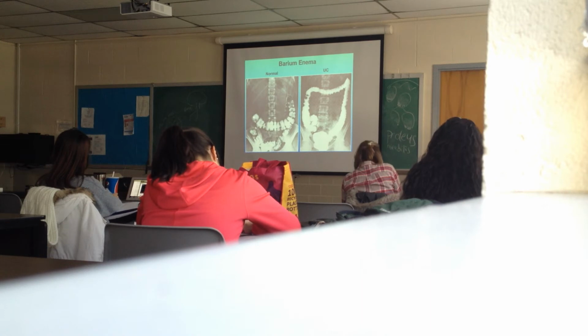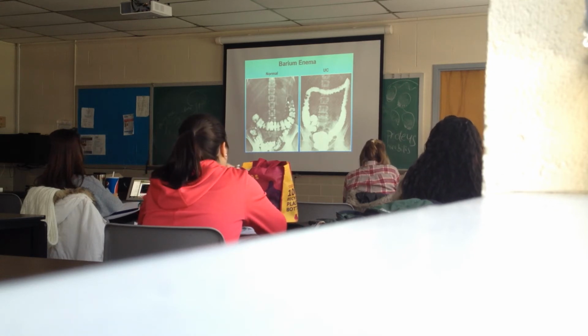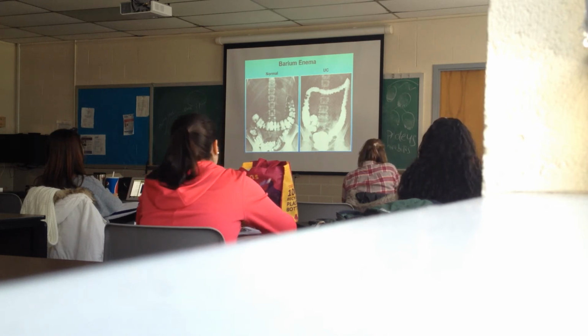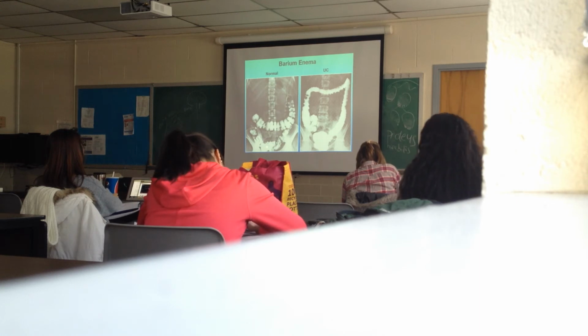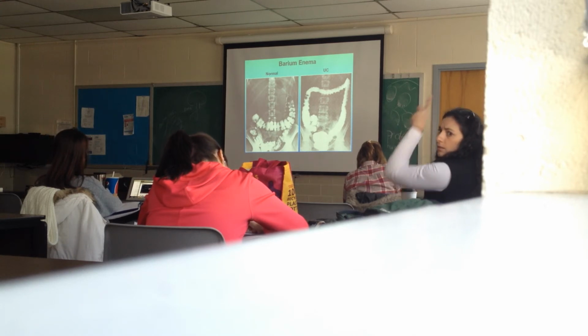That's the ileocecal junction, and this is the ascending colon. This little area where the large bowel bends is called the hepatic flexure, and the transverse colon here. Splenic flexure, descending colon, and sigmoid colon here, and that is the rectal vault. The rectal what? Rectal vault. Everything else here is small bowel.